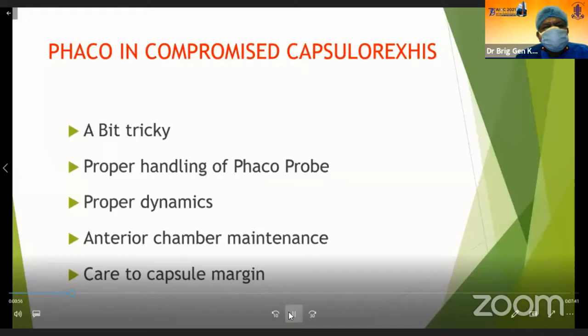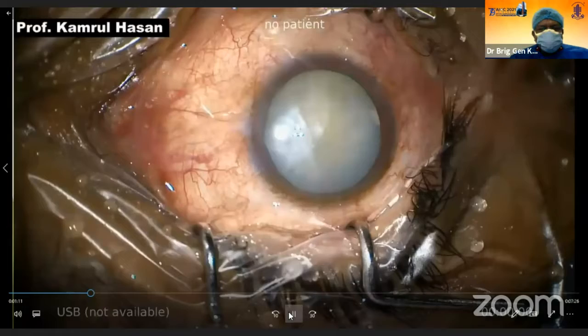Phaco with a compromised capsulorhexis is a bit tricky. Proper handling of the phaco probe, proper phaco dynamics, anterior chamber maintenance, and care of the capsule margin are of utmost importance. Here, I want to share a few videos.